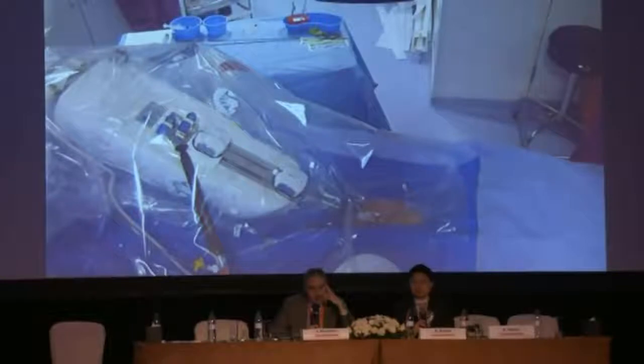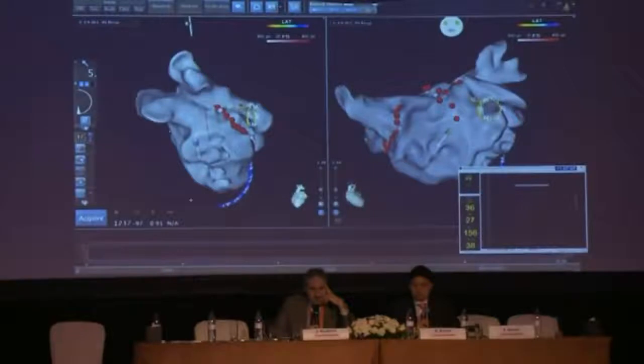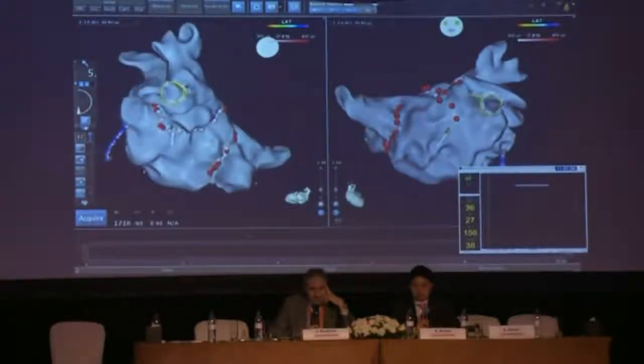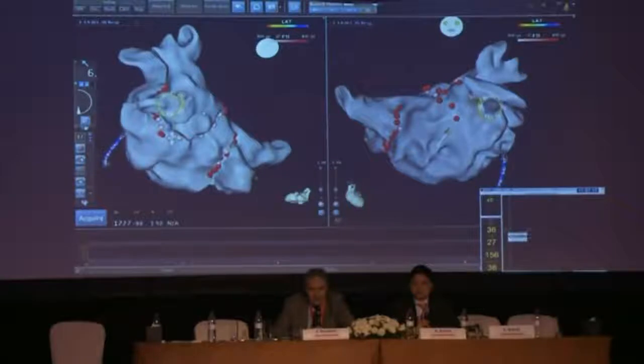Yeah, so if we look at the signals now, guys, we can see that I've moved into the left pulmonary vein, and that's reconnected. So there is still a little bit of work to do to really get that completely isolated. The earliest PV is 5.6 probably. Can we see signals now, please? Signals?